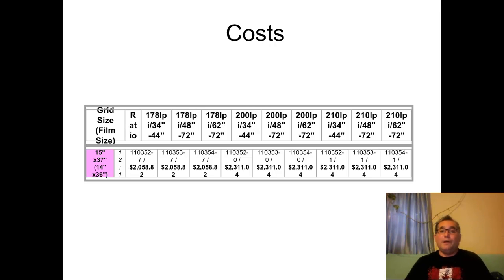So to sum up, in summary, the grids do nothing for patient dose compared to beam limitation devices, which can lower patient dose. Grids will improve contrast, so they are only good for image resolution, not for the patient. Grids vary in their size, but more importantly, they vary in their grid ratio, which is the height of the lead line divided by the distance between them, such that higher grid ratios have a smaller space between the lines and will thus annihilate more photons, leading to better contrast.